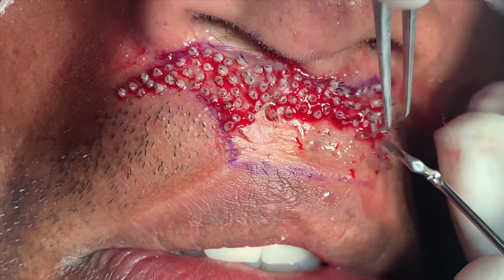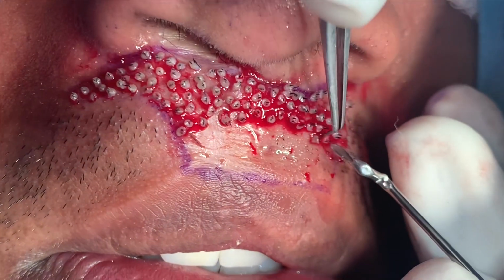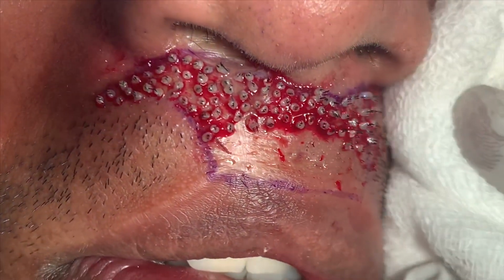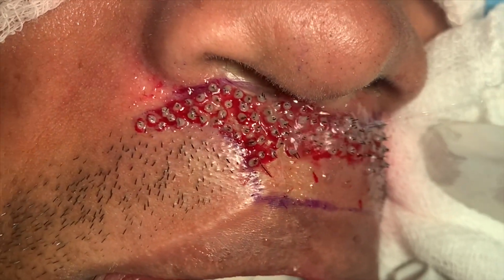We do this for our patients, and then if they need a few more follicles, you can always do this later because it's a very, very simple, super quick daycare procedure. I wouldn't call it simple, but it's a daycare one.